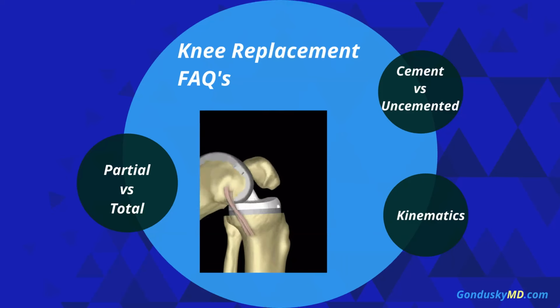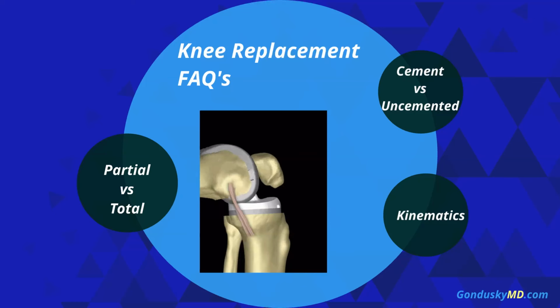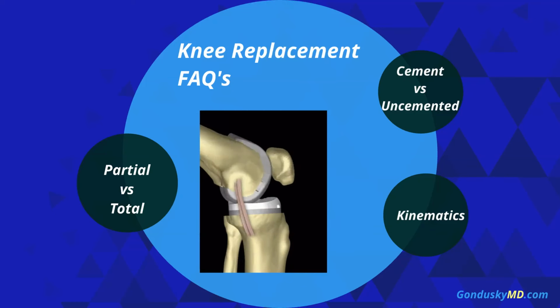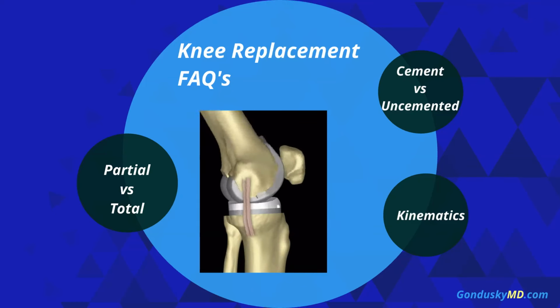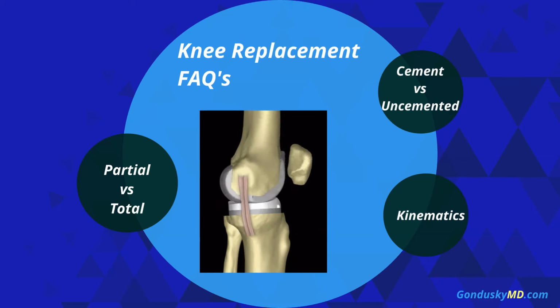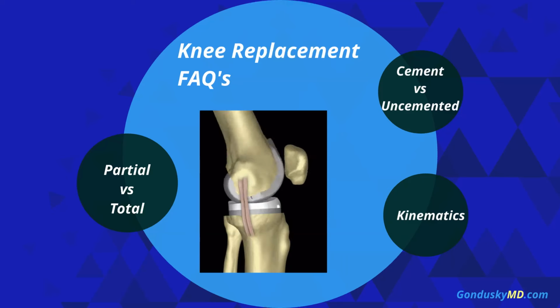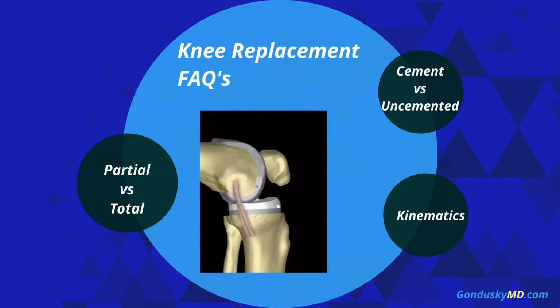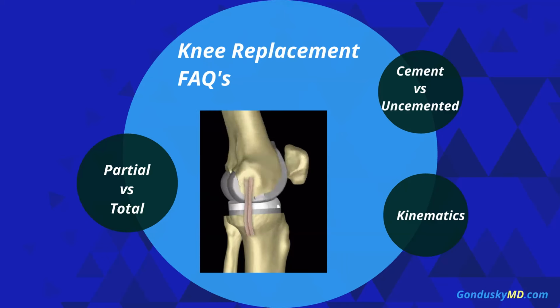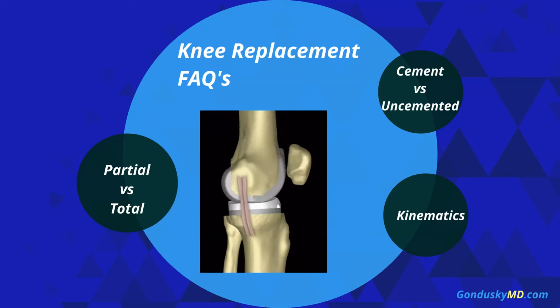Are there any differences in terms of the type of knee replacements? Generally, there are a lot of different companies that make knee replacements. There are large manufacturers whose knee replacements are sold at really high levels. So there are 3 or 4 companies that make up the bulk of those companies. There are some smaller companies out there that make knee replacements that aren't as well known, that are kind of smaller volume makers.